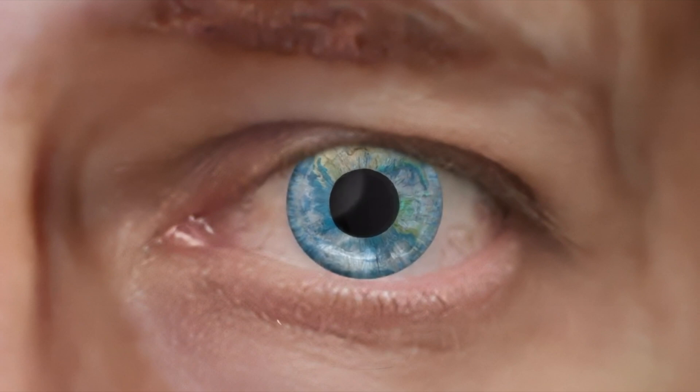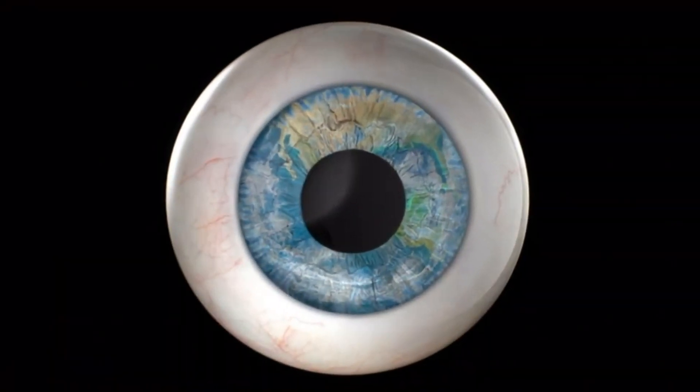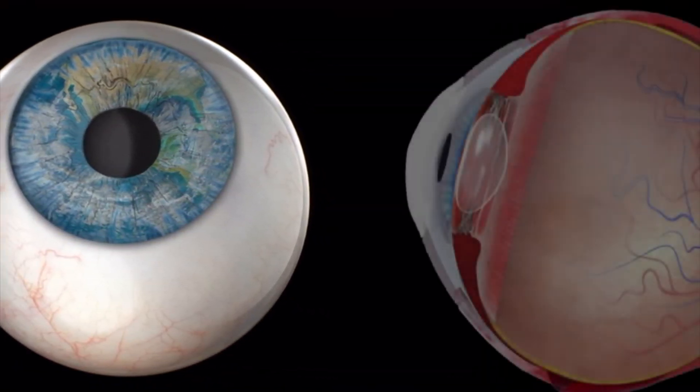Known as refractive lens exchange or clear lens extraction, the surgical steps are similar to cataract surgery. However, to understand what is happening, let's first take a look at normal eye anatomy.